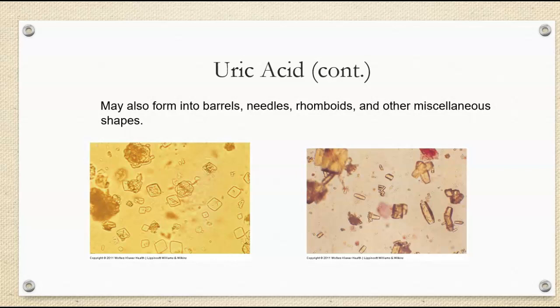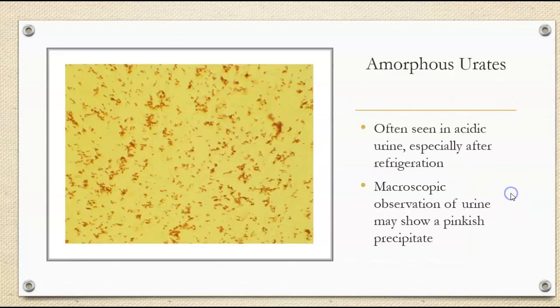So she'll typically do this. She had disagreed with the pathologist, and she kind of wanted to see what I had to think about it. So she'll typically give me no details and just ask me what it is. So this one was actually kind of a stumper, but I'm going to give it to you and see what you think, and then we can talk more about it after. But that'll come towards the end of the PowerPoint, because I got to pull up the slide.